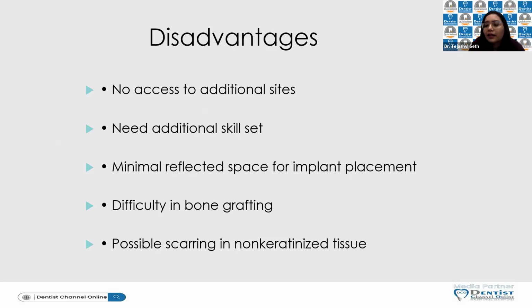if the space that we have is approximately 4 to 5 mm, so your 3 mm of space, we are not just opening the tissue, it is just the remaining amount of space in which we have to manage your implant placement or any kind of grafting that you require. So this is a bit technique sensitive, and you might require a lot of patience and additional skills to master it.